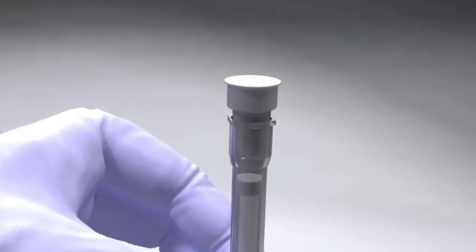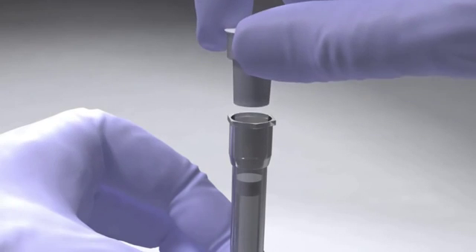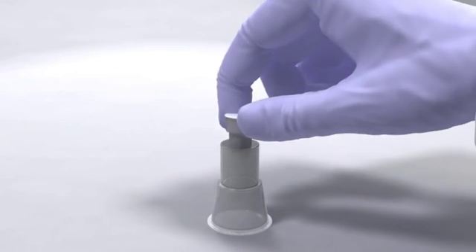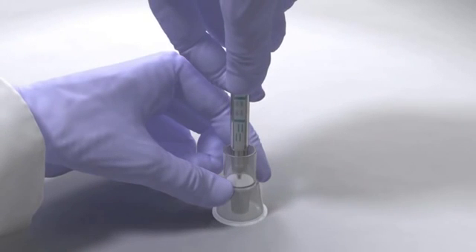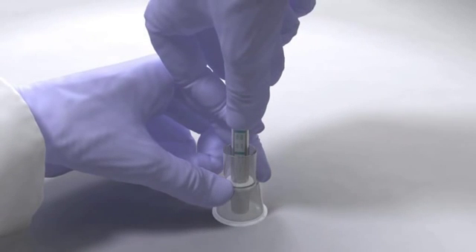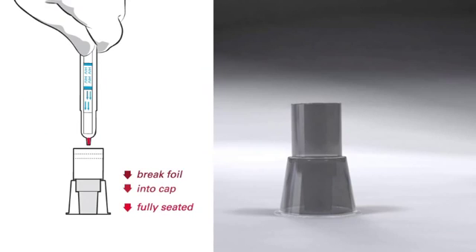Remove the buffer vial from the end of the SureCheck device and place in the rack or plastic stand. With the buffer vial in the rack or plastic stand, firmly press the tip of the SureCheck device through the buffer foil cover. Continue to firmly press the device to the bottom of the buffer vial until the device and the buffer vial snap together tightly. You'll feel or hear three snaps in the process.